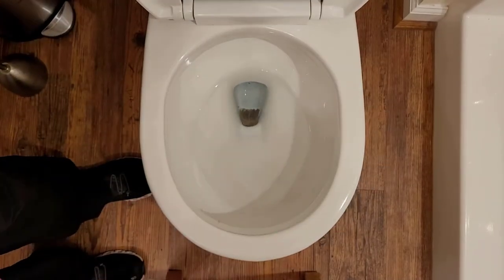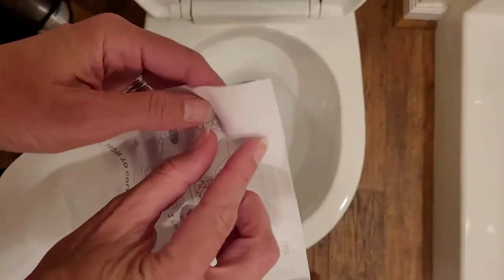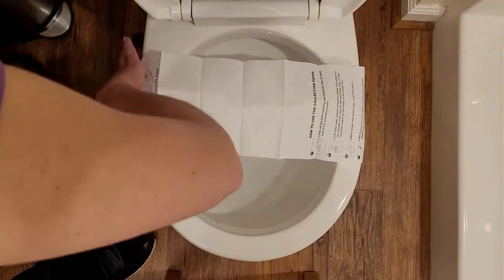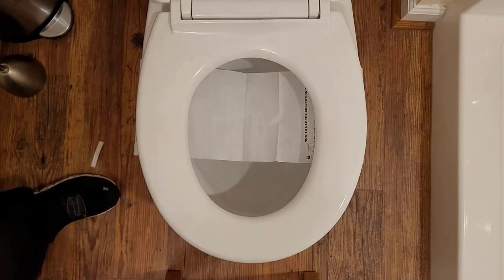Every kit comes with instructions. The first step is to put up the toilet seat and use the adhesive tabs to affix the paper to the back of the toilet bowl. Now you have a poop hammock, and every kit comes with two pieces of paper in case the first one rips.